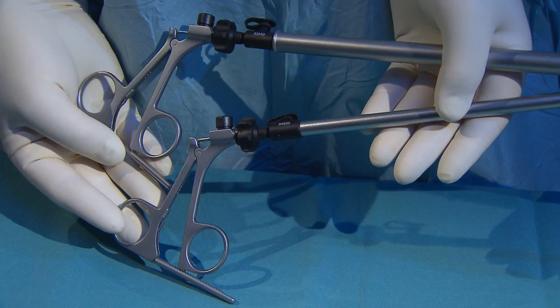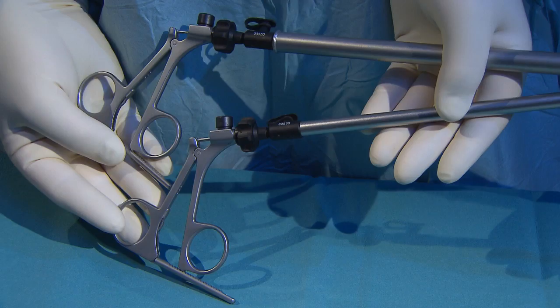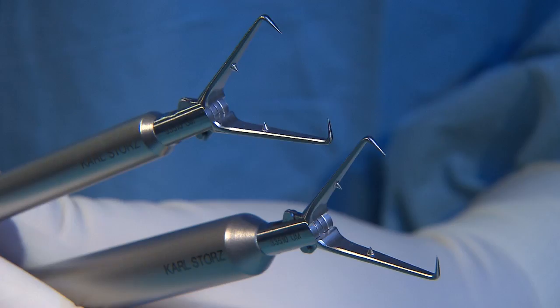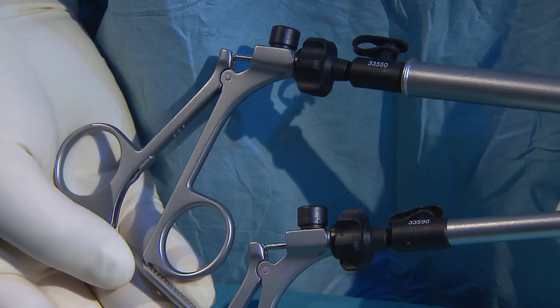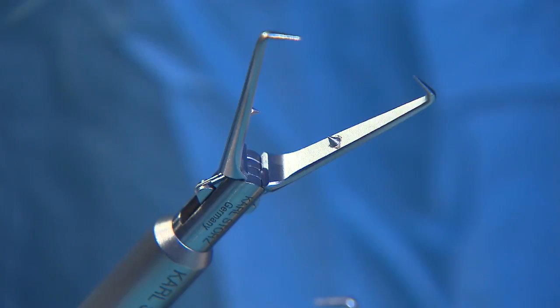The 10mm and 15mm, 180-degree rotatable tenaculum forceps are equipped with a handle catch. The double action allows the forceps to be opened wide to grasp and fixate larger tissue masses, which is particularly useful in myomectomy and hysterectomy.